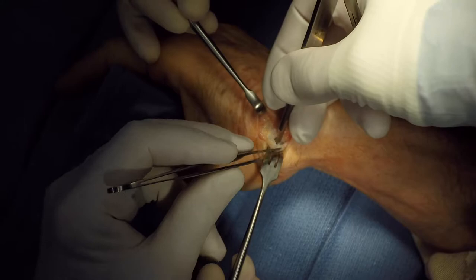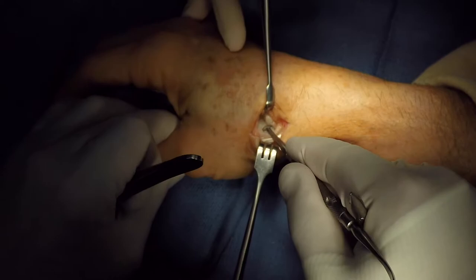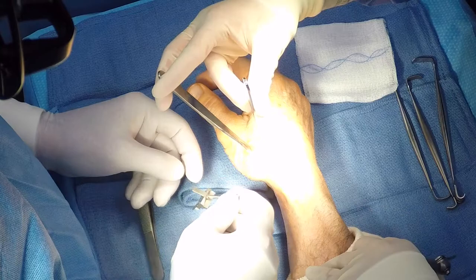de Quervain's tendinitis type symptoms post-operatively. We will elevate the APL insertion off the base of the metacarpal, identifying the interval now between the metacarpal base and the trapezium.